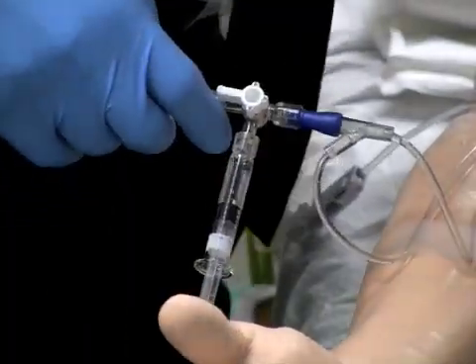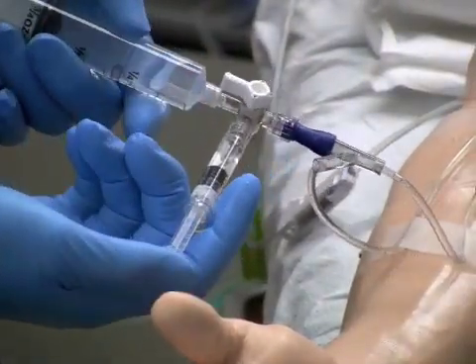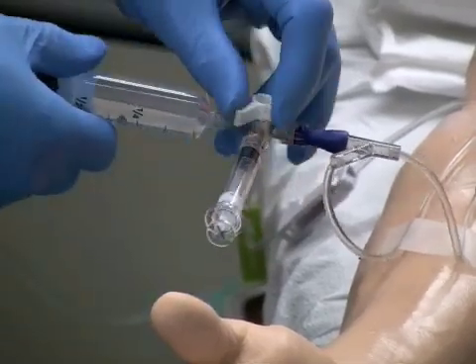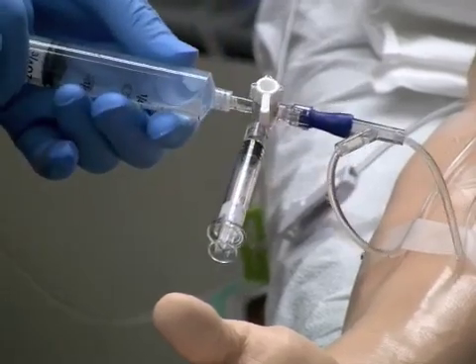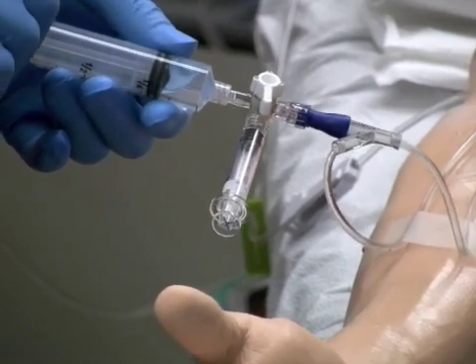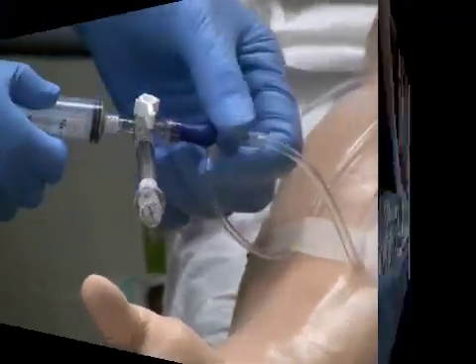Start our print. Give me a moment here. We're ready to go. So first — squeeze — it's pushed in. Then immediately swing that down and follow through with your syringe flush. 6 milligrams in initially. You're finished.